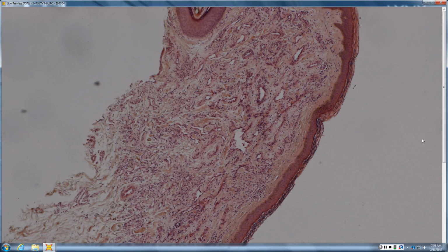Just probably a little papule. There's lots of ectatic vessels superficially. Ectatic vessels, and are they big and round, or are they all kind of flat? I mean, some are a little round. They're definitely not all flat, but most of them are probably flat. There's definitely fibrous proliferation. It could be angiofibroma or some other. Do you know any kind of angioma that's microvenular? Microvenular hemangioma. That is correct. The microvenular hemangioma just lives up to its name, where it's got all those little flat vessels.